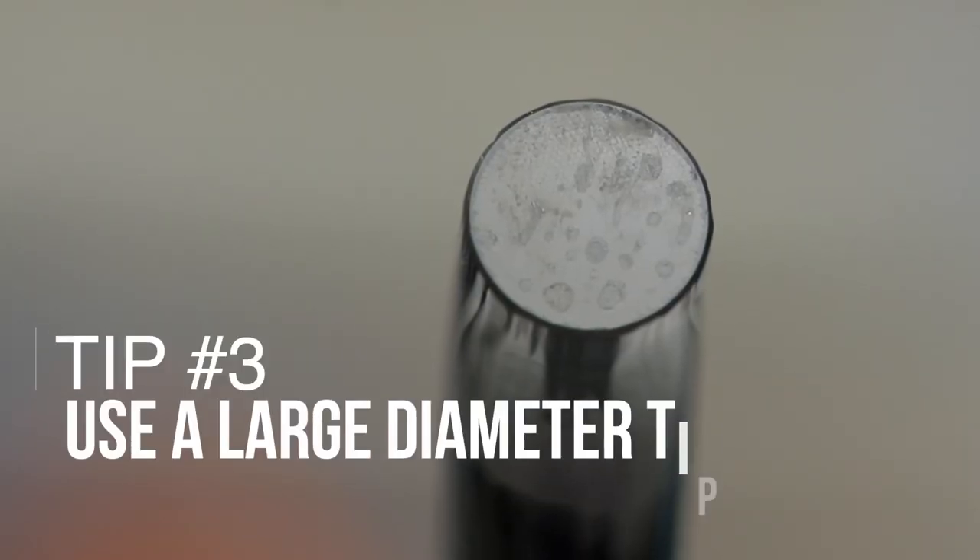Tip number three: use a curing light that has a large diameter light tip — something greater than 10 millimeters. If your tip is less than 10 millimeters, you're going to take longer to cure restorations, especially larger ones. You'll have to do multiple overlapping cures to ensure complete cure throughout the entire restoration. Even with a high output curing light, a small tip diameter still requires overlapping exposures.